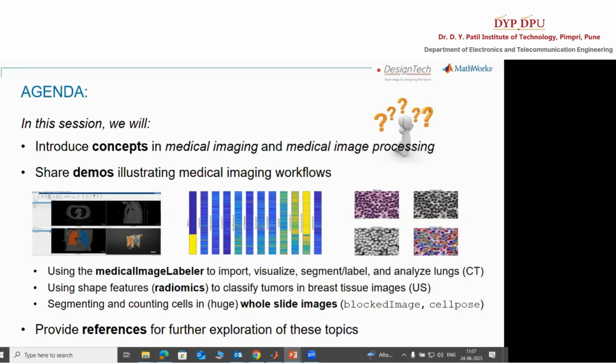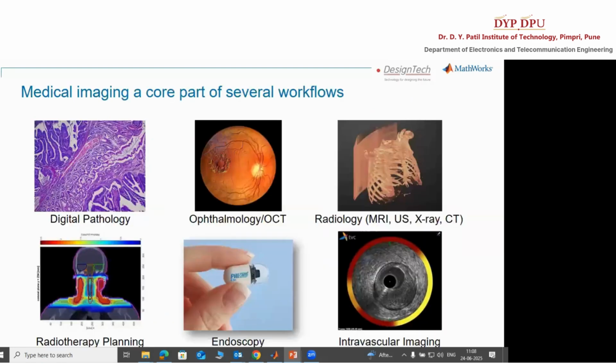You can do it with MATLAB. As I told you yesterday, we have very rich documentation. So of course I highly recommend using the documentation for your future work.